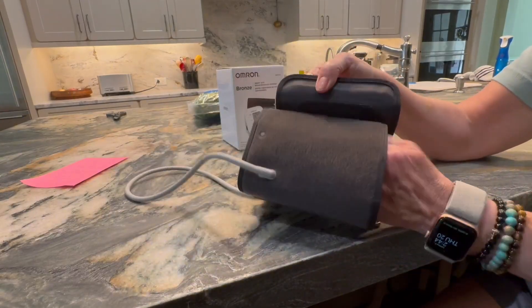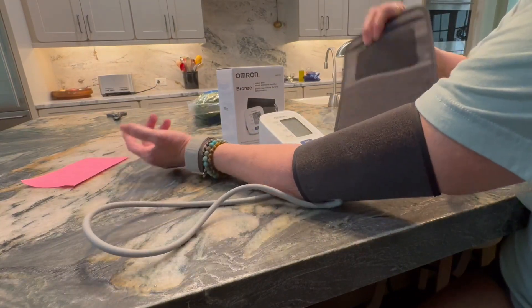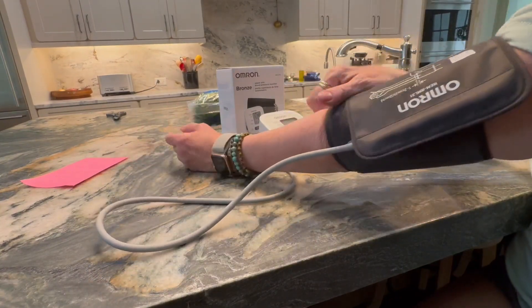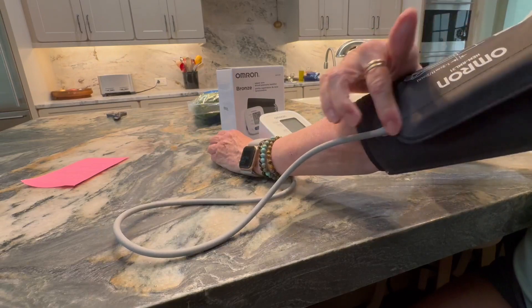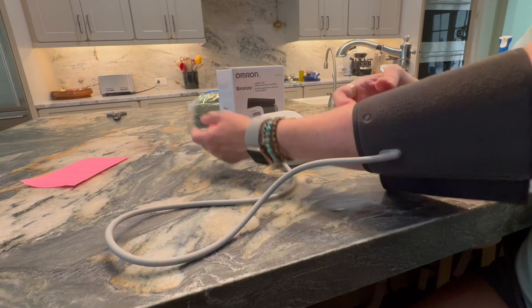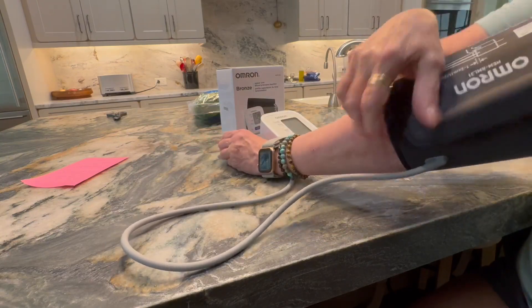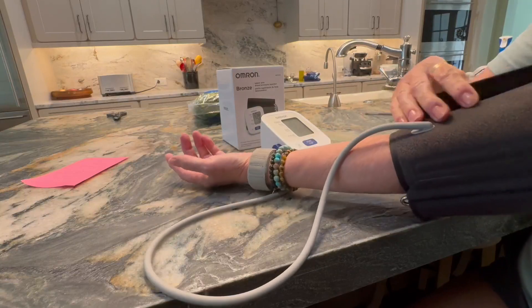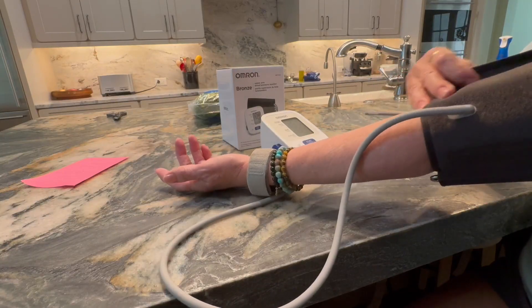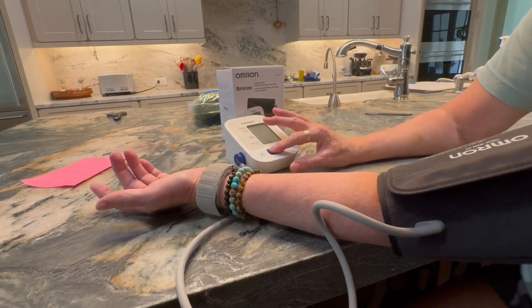You just slip it on your arm like this, then you pull it around so it's kind of taut, but you have to make sure that this bubble piece right here is on the front part of your arm. Just keep turning it around until you get it lined up with your arm just like that, and then you push it.